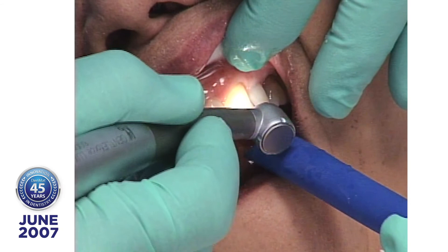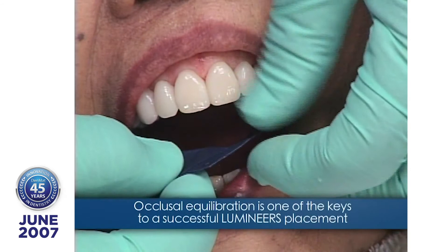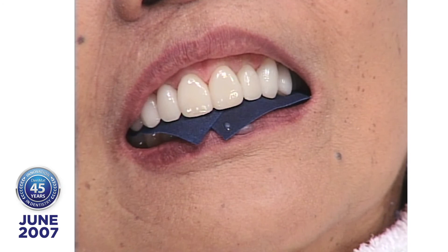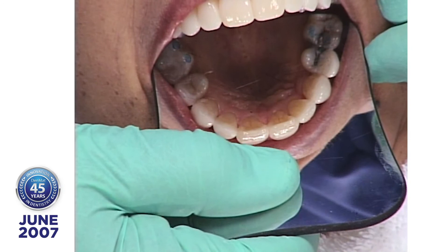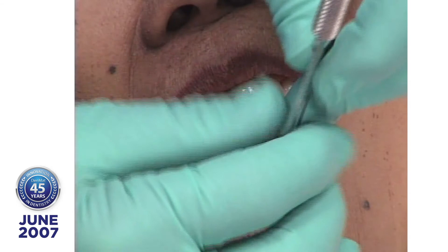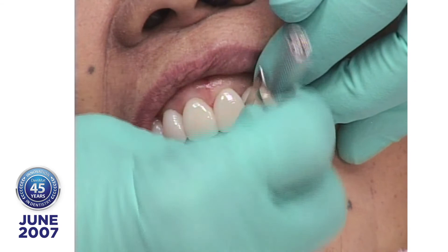Now we'll take some marking paper and check the occlusion. Look how nice that anatomy looks. You can change anything you want after it's bonded — you can contour it and polish it. She's marking on her natural teeth. I have a thing here called the Seri Saw, developed by a dentist by the name of Harvey Putter. We just start opening the easy contacts. I start sawing, and if the sawing gets a little hard, then I stop and rock. And that contact's open.